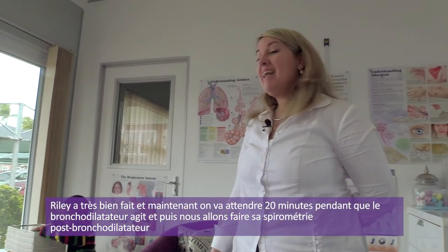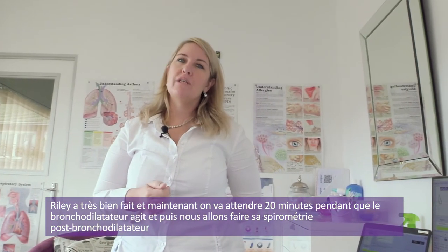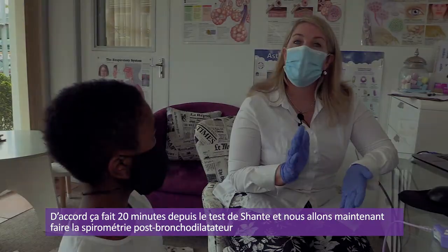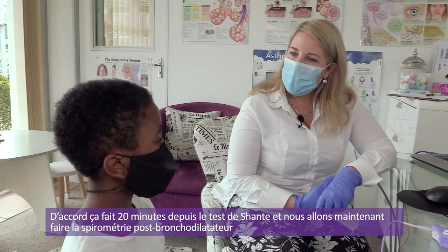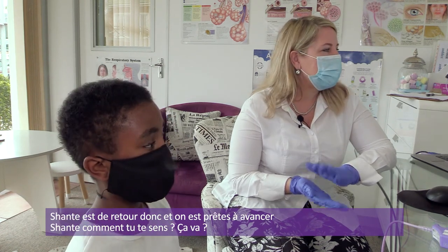Okay, so Riley did very well. Now we're going to wait 20 minutes while the bronchodilator takes effect, and then we are going to do his post-bronchodilator spirometry. Good. So it's been 20 minutes since Shanti's test, and we are now going to do the post-bronchodilator spirometry reading. So Shanti's back, and we are ready to go.